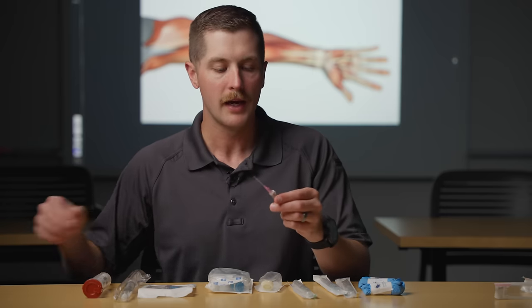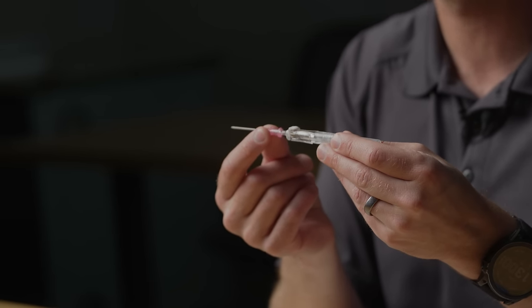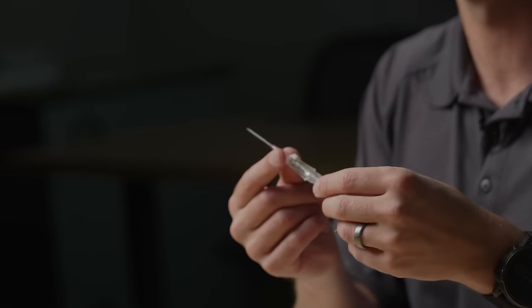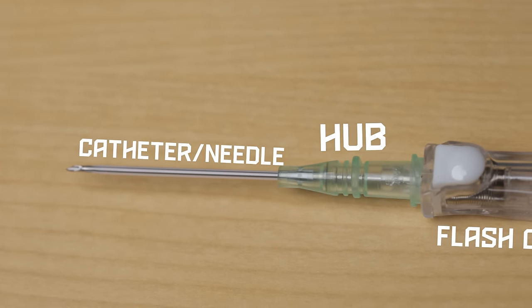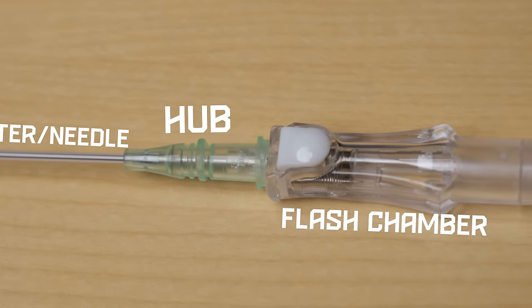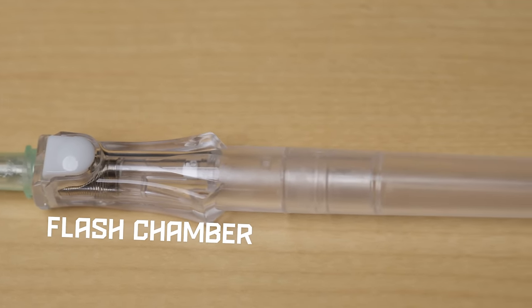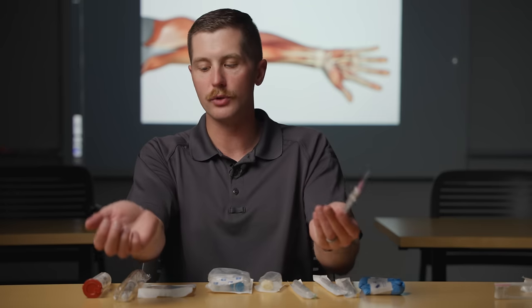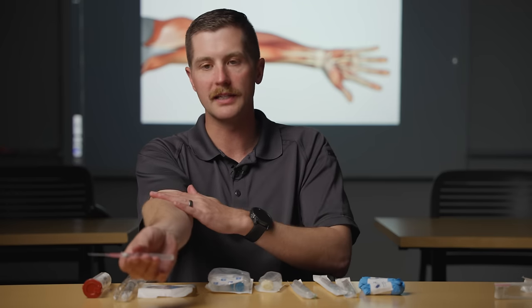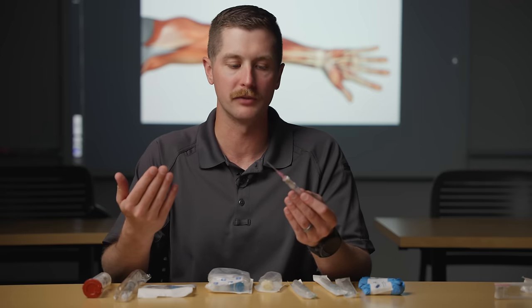You can see that we've got the needle at the front and then this is actually the catheter that slides into the vein. Unlike IVs from 20-30 years ago, this doesn't actually keep a needle in your arm — it keeps a clear plastic tube so no matter where it is the patient can still bend and move without worrying about a needle sticking through the vein. Be aware though, if you start an IV at the AC or anywhere near a crease or joint they might occlude the flow of a drip, so they can be relatively positional.